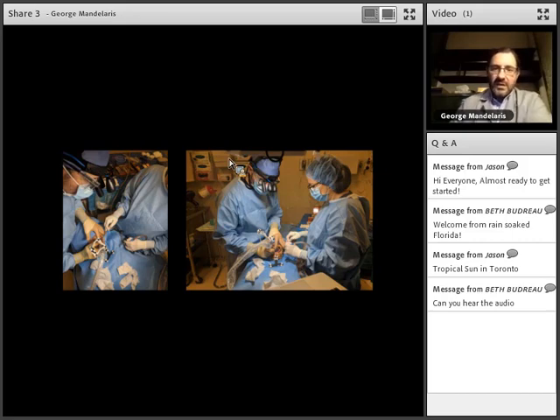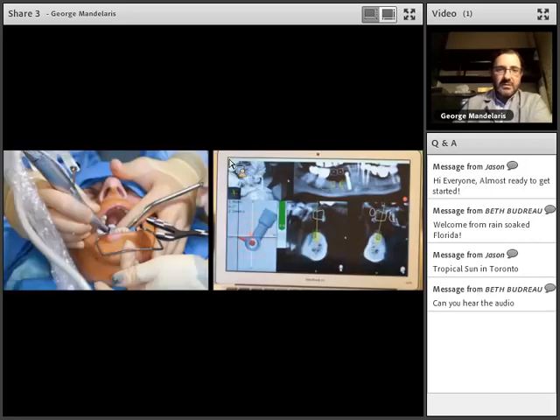My assistant Gabby is checking the patient, making sure there's no bleeding. She's making sure that the osteotomy site is looking good. She's got her eyes on the patient and the oral cavity, but my focus is really on the computer after all the accuracy checks and making sure that that is correct. Same thing there. Now, most of the time I like to think that I'm pretty good, but this technology really tends to humble you.